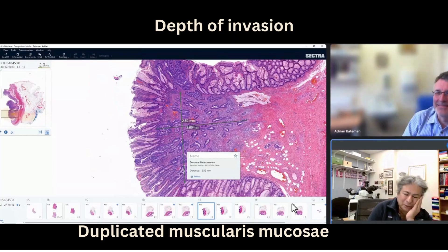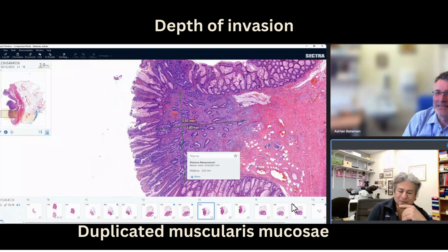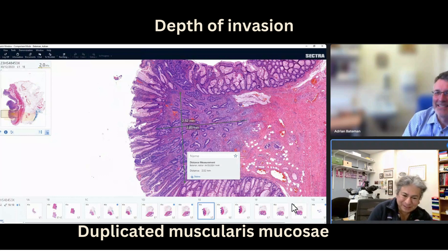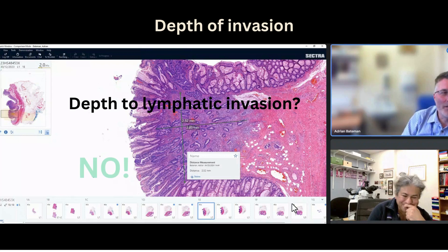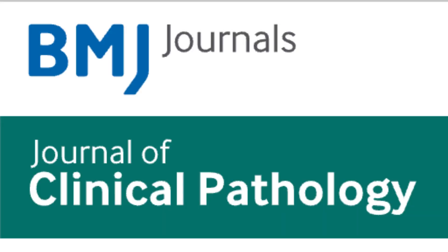One final question before we move off this image: would you measure the depth to that lymphatic invasion? I haven't done that, actually. In this case, I think I would measure the primary tumour. There might be a large tumour, so I think if you just remember the lymphatic invasion — as a general rule, I think it would be appropriate.